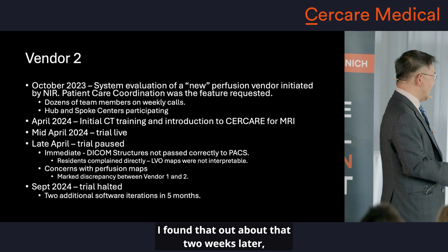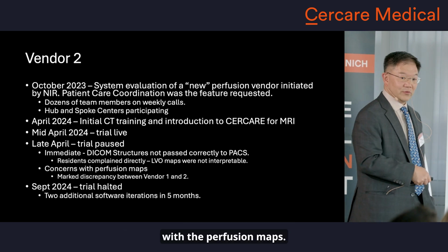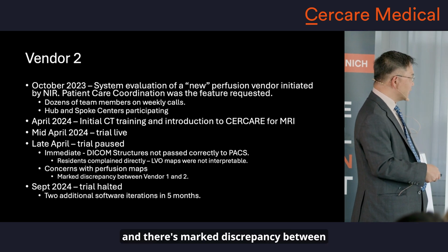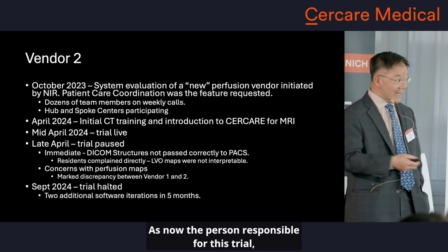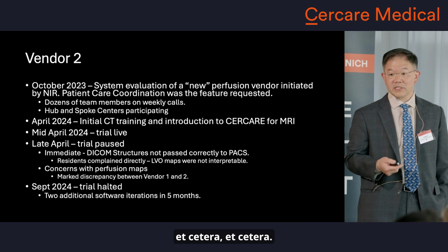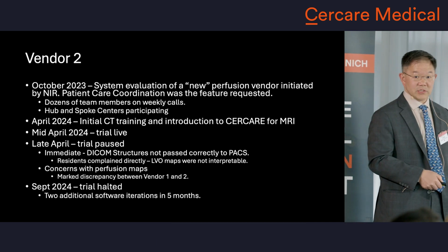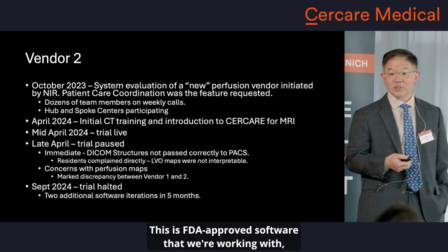I found out about that 2 weeks later, and then started having major concerns with the perfusion maps. Again, this is a different vendor. We'll call them vendor 2, and there's marked discrepancy between vendor 1 and vendor 2. As now the person responsible for this trial, I started communications with vendor 2 and said, hey, what are we doing? What are we doing wrong? Et cetera, et cetera. Long story short, after 2 more software iterations, this is FDA-approved software.